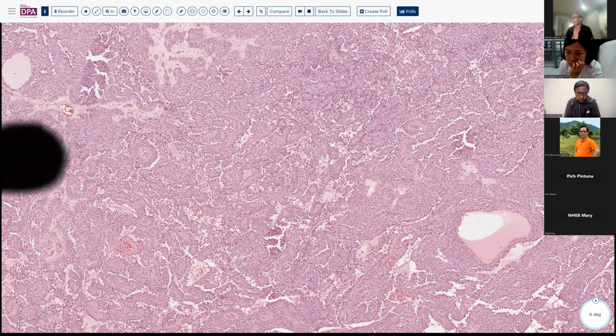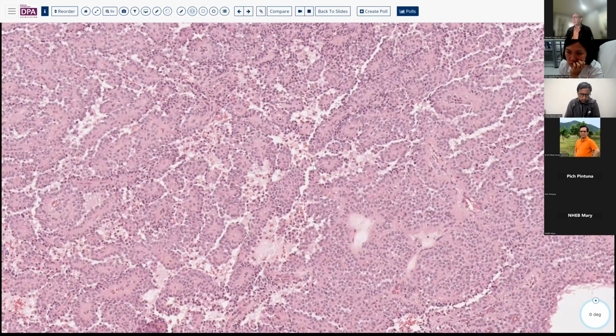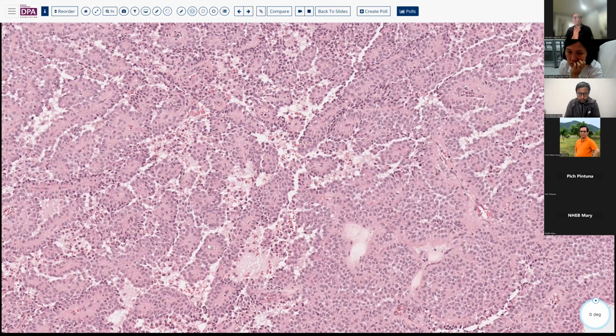But in fact, these are fibrovascular cores, and there is a cell radiating out from these central little hyaline cores that extend. But they're oftentimes contiguous with the adjacent ones if you have good fixation and good circulation and a fairly young patient. But you can get areas of degenerative change with necrosis, and then these areas tend to become more pseudopapillary, or they tend to become more papillary because they will become more discohesive one to another.